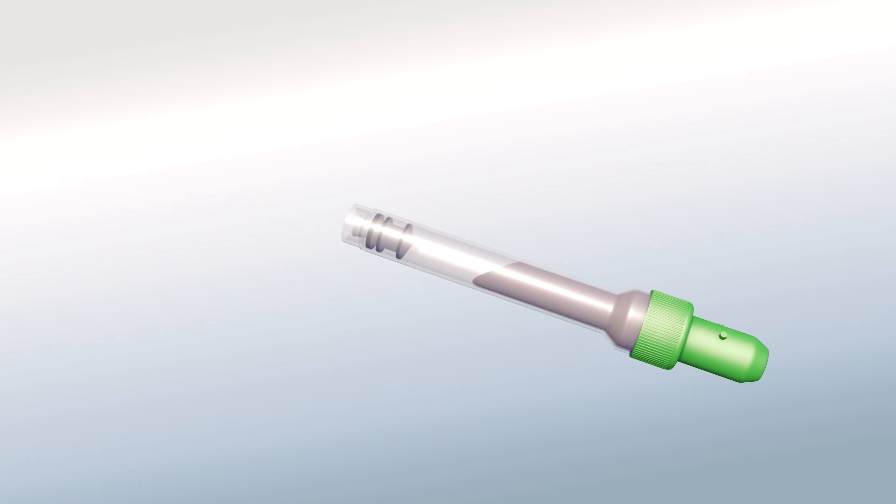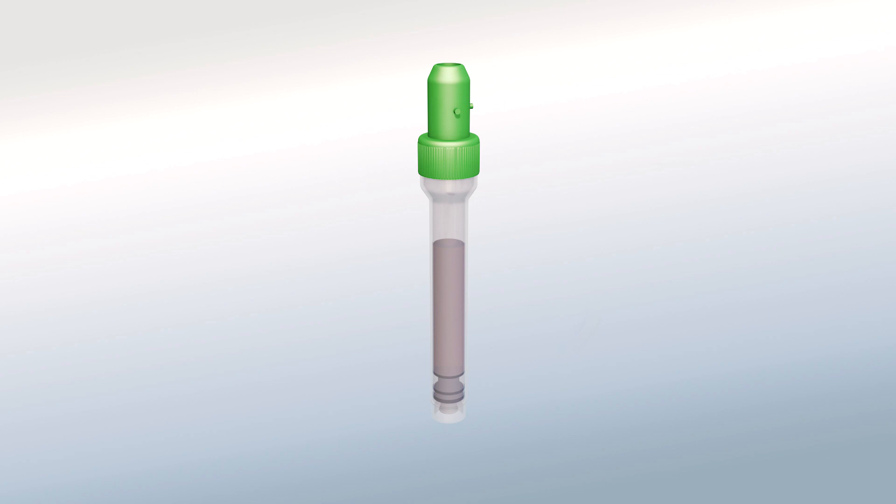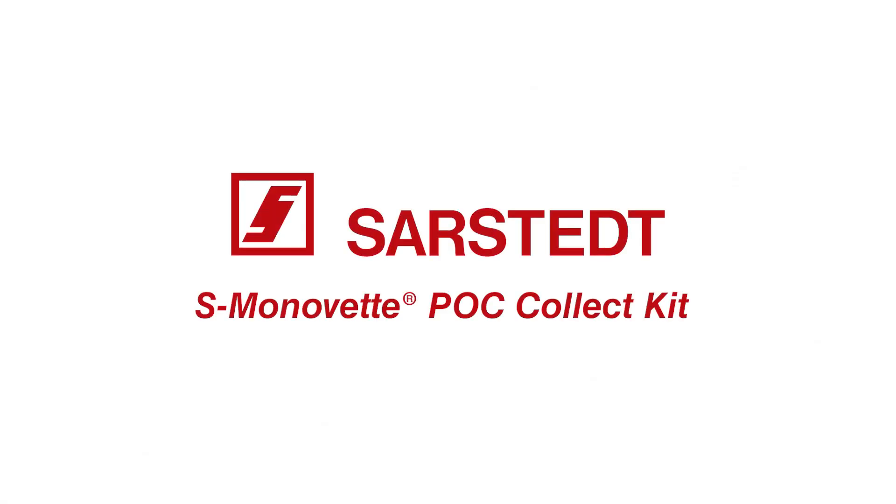Otherwise, dispose of the tube in your biohazard waste. This dual technology provides healthcare professionals with a point-of-care result that decreases turnaround time, leading to improved patient outcomes and facility proficiency. The new S. Monovet PoC Collect Kit from Sarstedt, your worldwide partners in medicine.